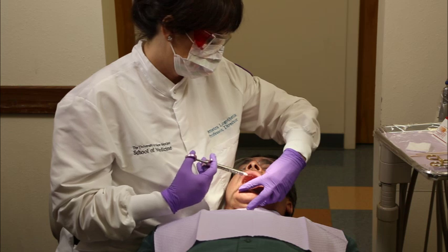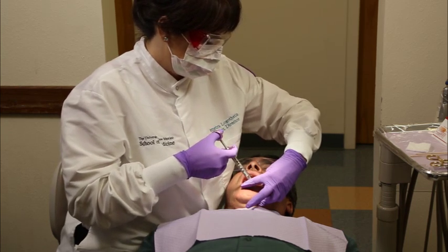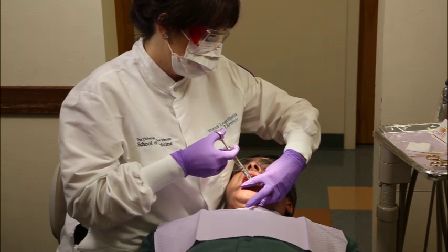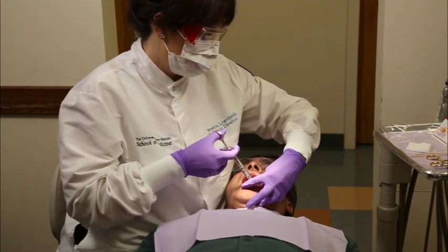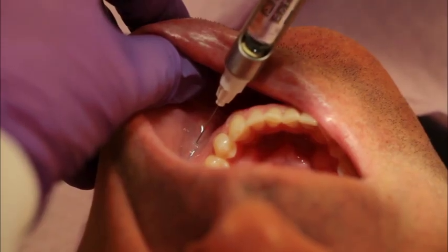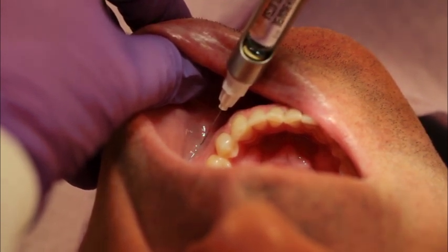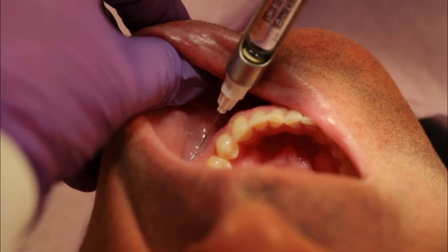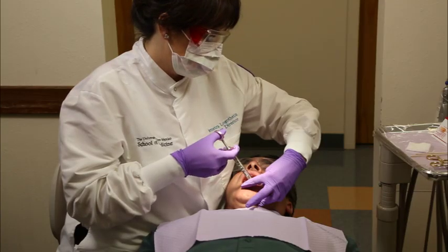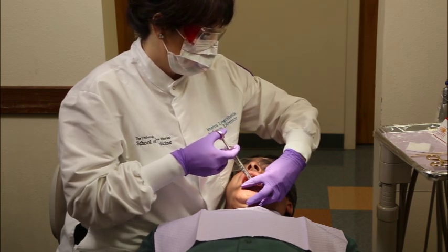For the horizontal approach, establish a fulcrum and then direct the syringe from the anterior of the mouth to the posterior in a horizontal manner, with the syringe barrel resting on the patient's lower lip and on the index finger of the retraction hand. Insert the needle to the depth of the mucobuccal fold, directing the needle anterior to the mental foramen, approximately 1/4 the depth of the short needle, or 5 to 6 millimeters. Aspirate by pulling the thumb ring back gently 1 to 2 millimeters at the injection site to prevent the possibility of an intravascular injection.